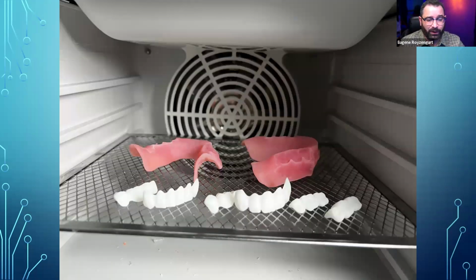Okay. So once I've printed things, obviously with this resin I was using the cleaning concentrate because it's ceramic based. Denture base is not ceramic filled, so you can use regular alcohol. Just remember, guys, you need to have separate cleaning protocols for your model resins that are not FDA cleared to go intraorally versus your, let's say, denture base or try-in resins that go intraorally. Because if your resin is not FDA cleared to be used intraorally and you use the same alcohol that you use for FDA cleared stuff, you're going to contaminate stuff and that could cause some issues down the line. So I have separate baths, one for FDA intraoral stuff and one for non-FDA stuff, okay?